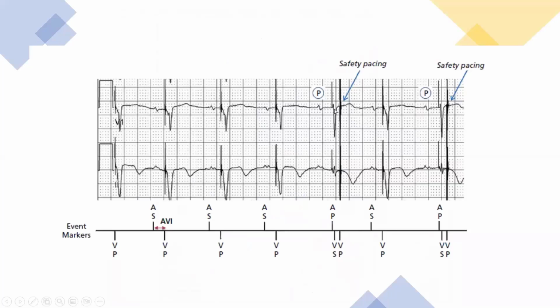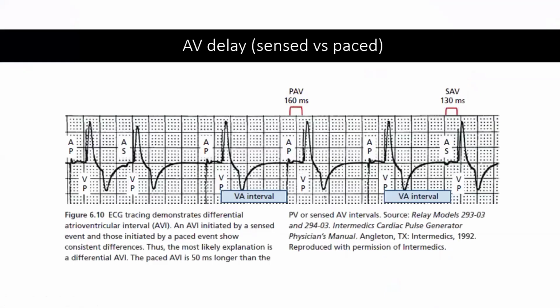Like this tracing, I have pacing, and this of course problematic because the pacemaker didn't feel this P wave. It's under sensing. This is a problem of sensing of the pacemaker, and this caused the pacemaker to fire here, like it's not felt the QRS complex. So this is atrial spike, and the native QRS was happening here, so it felt the QRS complex. So he misinterpreted everything and caused a safety pacing. This will become much clearer in troubleshooting lectures.